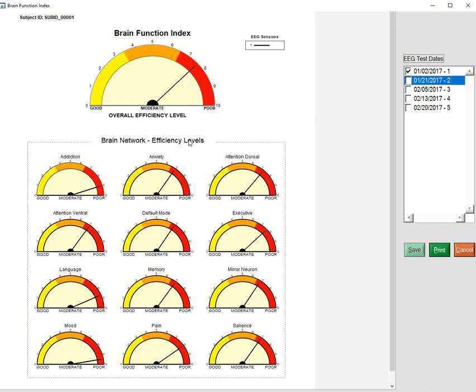So you can see, for example, in this individual that the addiction network is pretty much at nine. The anxiety, on the average, the discriminant distance from the peak performing group is seven. And that's what you see here—that's the average of each of these networks.